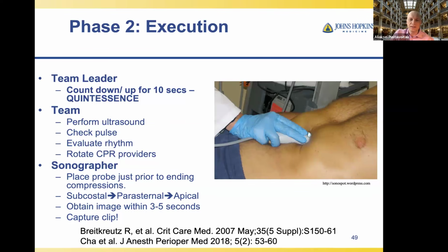And most importantly, hitting the save button to save those images so they can be reviewed. The team will perform ultrasound, that's the sonographer. They will check for pulse, they evaluate rhythm, and they will rotate CPR providers. Remember, doing CPR is hard work. Chest compressions are a physical job. So you want your team to be successful, you rotate them.